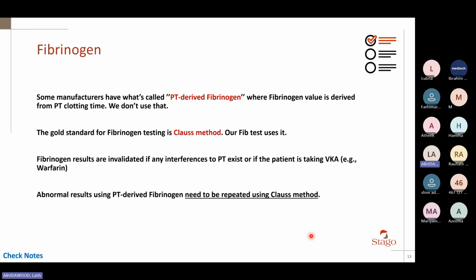Now, moving to fibrinogen. There's not that much to talk about in fibrinogen. Okay, it's relatively simple.